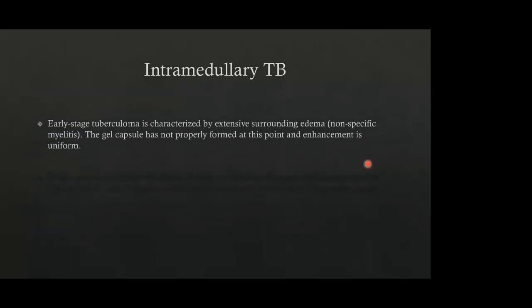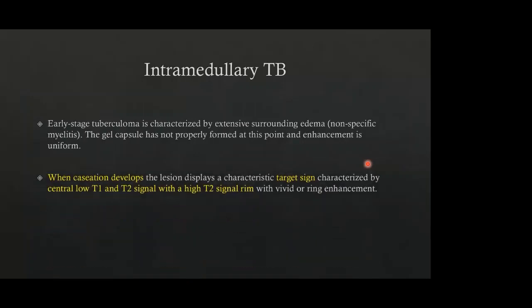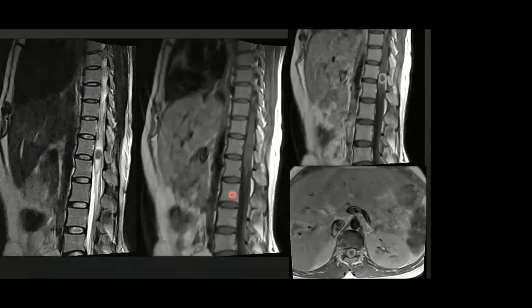Intramedullary TB is also rare but can be seen. The early stage is a non-specific myelitis with uniform enhancement. When caseation develops, the lesion displays a characteristic target sign: central low T2 and T1 signals with a high T2 signal rim and either vivid or ring enhancement. On these images, a rounded T2 hypointense lesion involving the conus medullaris is shown with a subtle rim of T2 hyperintensity in the periphery, diffuse cord edema, iso-to-hypointense appearance on plain T1, and ring enhancement on post-contrast sequences — an intramedullary tuberculoma.